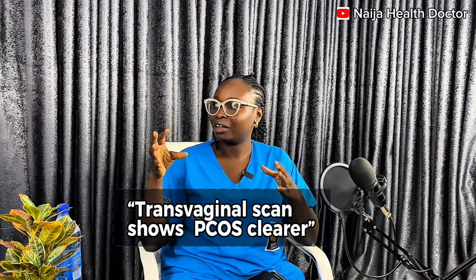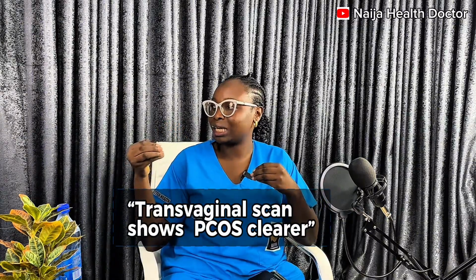You will appreciate transvaginal scan if you want to view PCOS. Yes, it's more clear. And sometimes for early pregnancy, it's more clear. Sometimes at 6 weeks, you might not see a gestational sac for some people, early pregnancy. For pelvic scan, in a transvaginal scan, you will see it. It will be very clear. The measurements will be close to accurate.